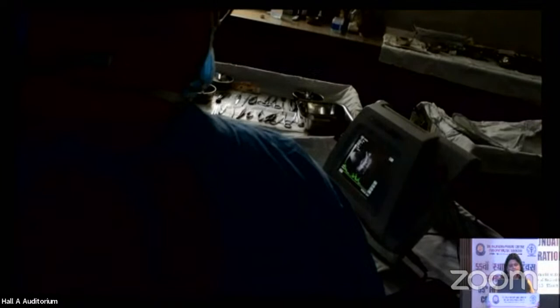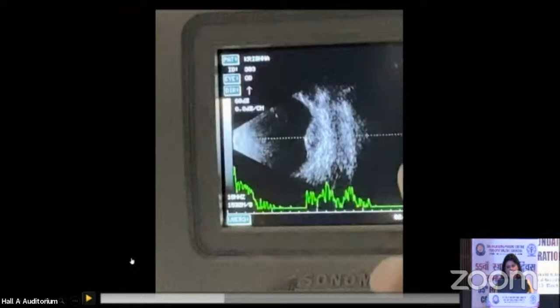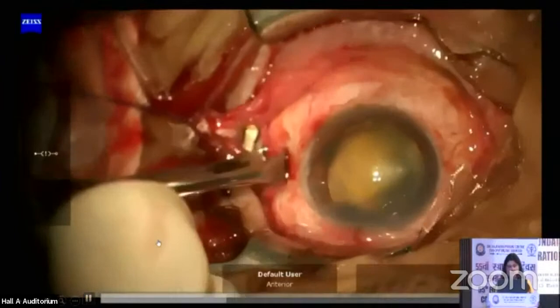And again, once we do that, here you can see the ultrasound. So I'll pause a little bit here. What we have done now is that we have placed the dummy plaque here. And when we place a dummy plaque, you can see this dense object over here. And you can see that there is a shadowing behind it, confirming the place of the plaque. So here it is, you can see.